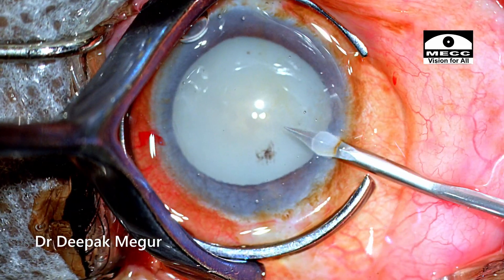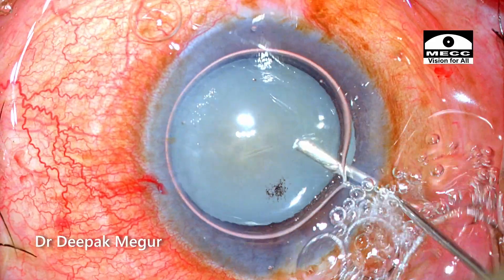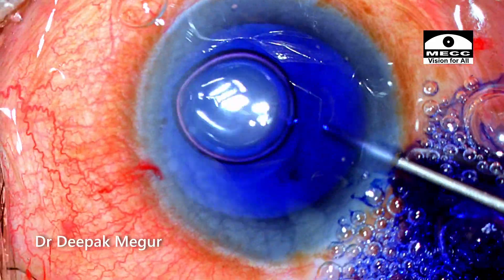The intraocular pressures are controlled. The cornea is cleared off so visualization is not an issue here. Staining of the capsule is done.